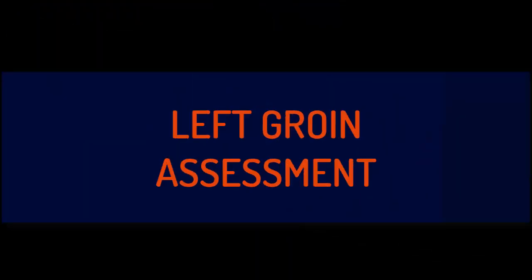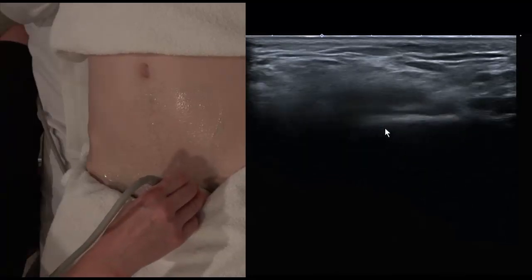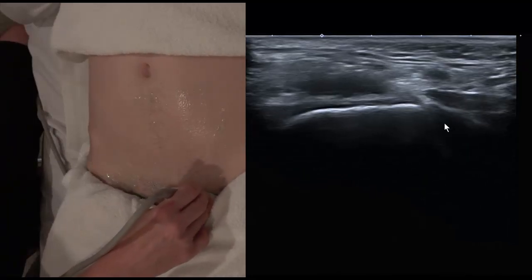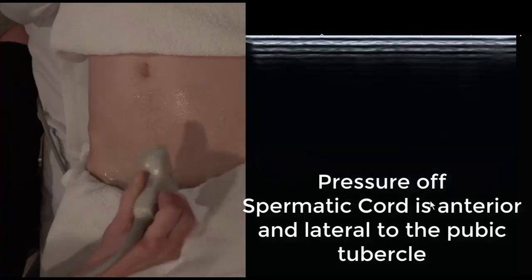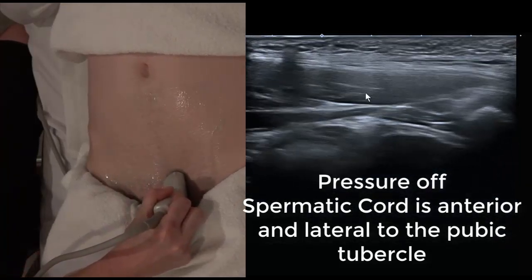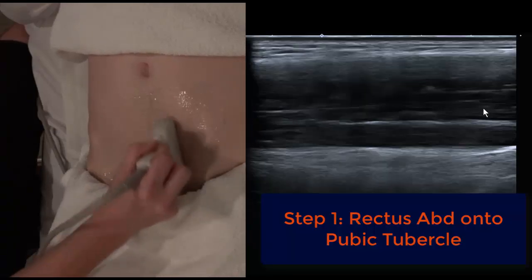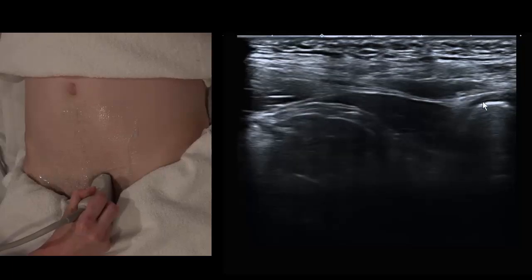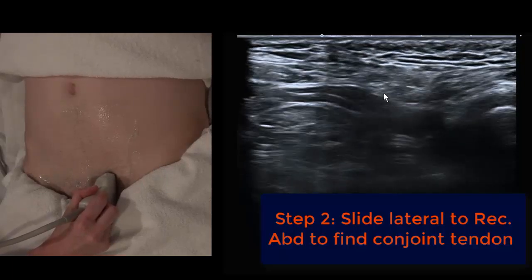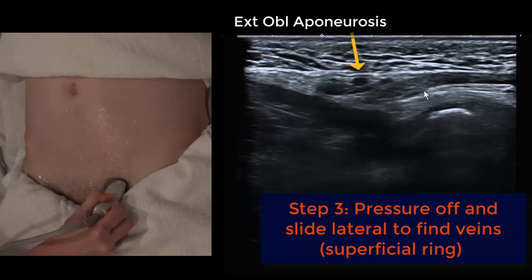Now we'll have a look at the left groin and follow those steps again. Find the rectus abdominis and run it down to the pubic symphysis — there's the pubic tubercle. We can see the little pyramidalis muscle above, and the spermatic cord. Turn into longitudinal, find the pubic tubercle, and slip slightly laterally until the rectus abdominis disappears. You'll see a thin white line representing the conjoint tendon, and a little more laterally you see veins. We've now fallen onto the spermatic cord, the pampiniform veins, and the superficial ring.